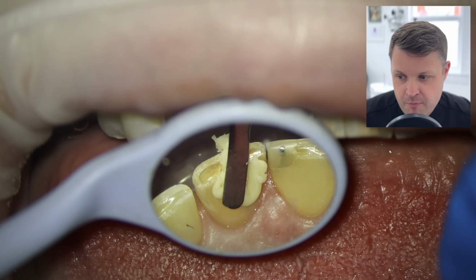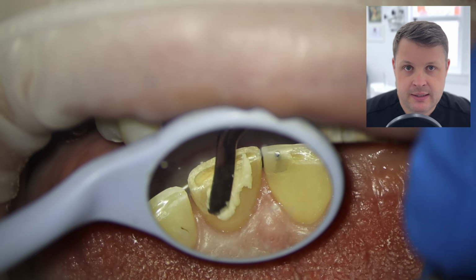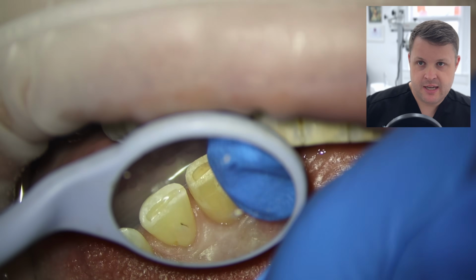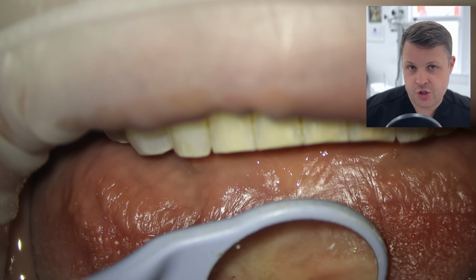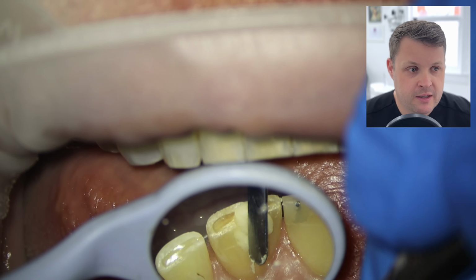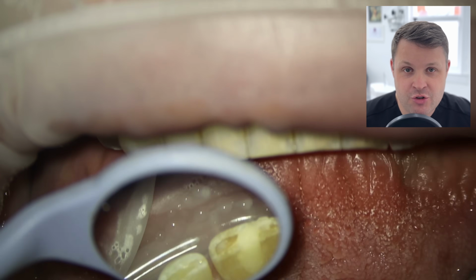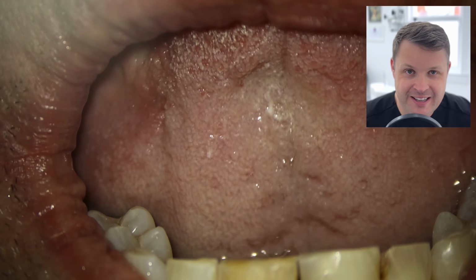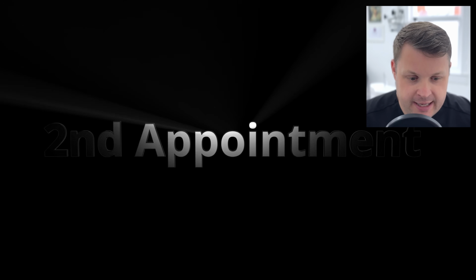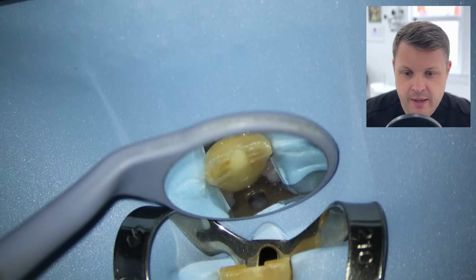And I'm thinking to myself, maybe I've perforated this tooth in the palatal aspect, and all of the X-rays that I've taken have essentially been down the long axis of the tooth. So the periapical radiograph has been perpendicular to all of my instruments, all of my checking, all my GP, etc. As soon as we get the patient back in the chair, I make him aware of the possible situation of a perforation, and I'm going to place a rubber dam on straight away.